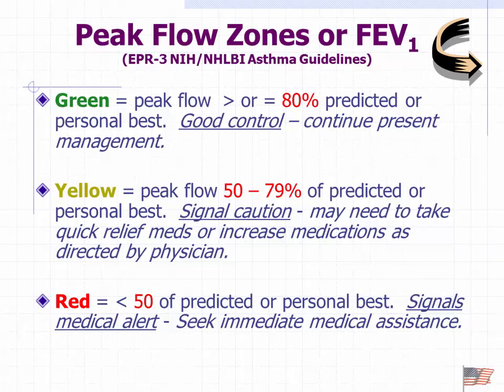This is a mechanism by which a patient with asthma can manage their own symptoms by using a quantitative method of measuring their peak expiratory flow rate. Truly, an asthmatic should never show up in the ER. They should be able to be managed as an outpatient. Like a diabetic really shouldn't come into the ER.